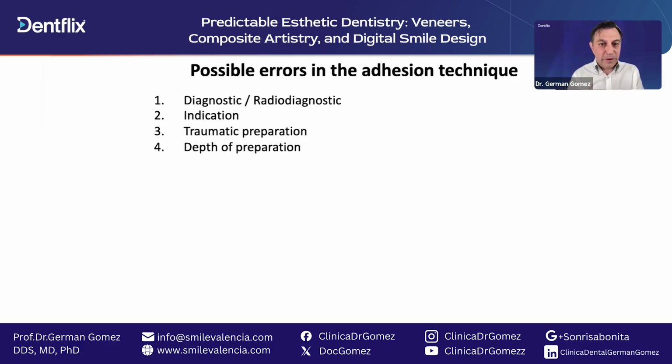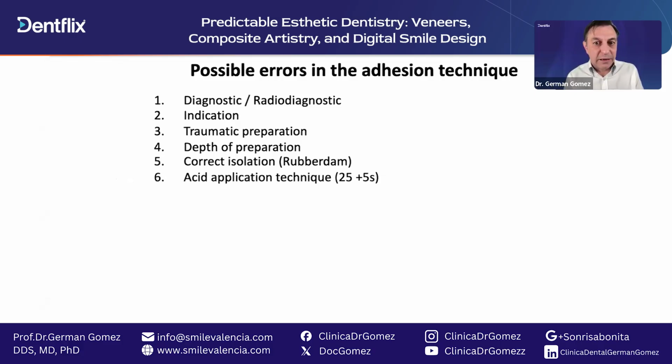Then depth of preparation. The deeper we get, the more we can fail, because we kill the tooth. Then correct isolation. Do we use a rubber dam or not? Sometimes we don't. Then acid application technique. Is it the correct one, or do we just use 15 seconds for everything? Then the drying technique. Do we dry enough, or do we leave it moist for our adhesive system?